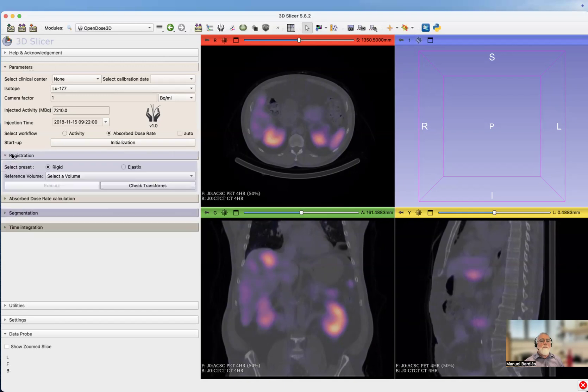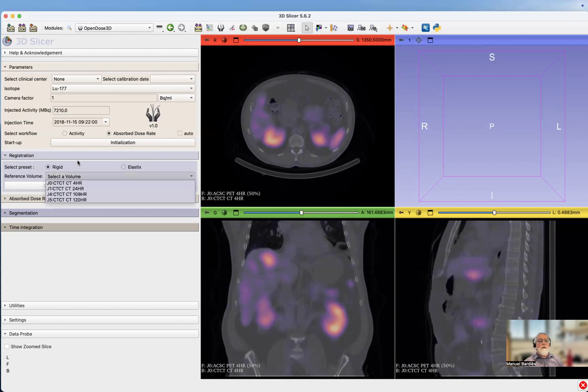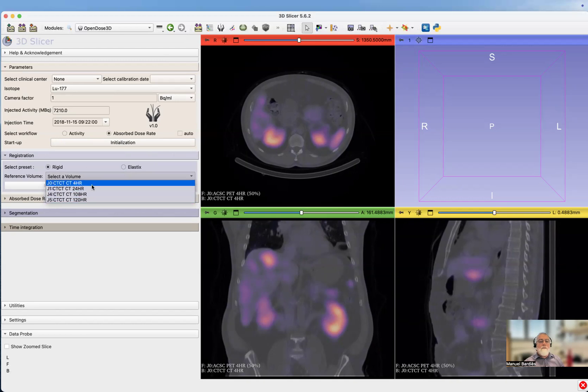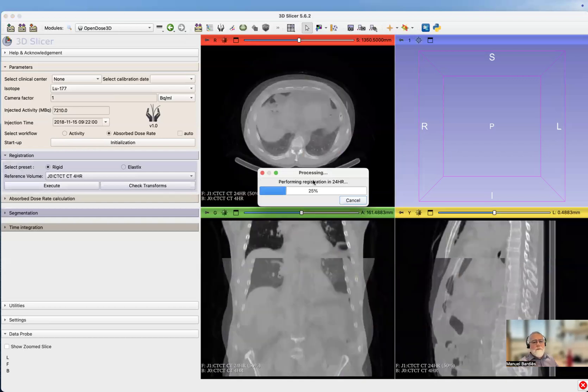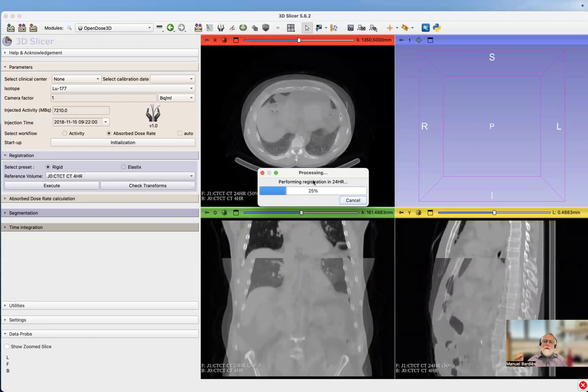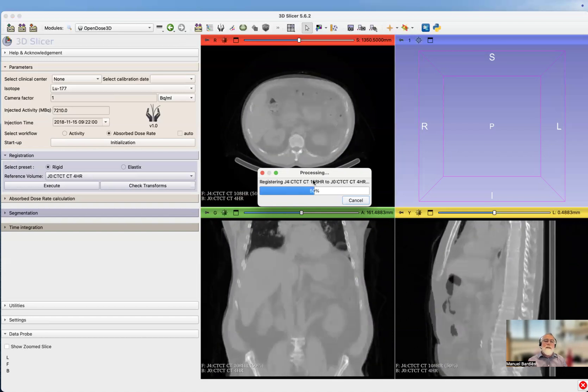Now what we need to do is register images. For the sake of the demonstration, we're going to select rigid registration and we select the reference image here, the CT at four hours, and we execute. It's going to try to register the three other CT to the CT acquired at day zero, four hours.